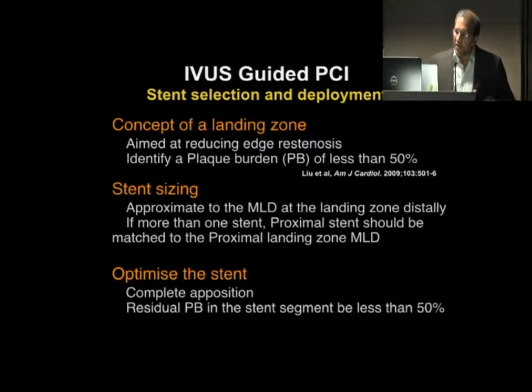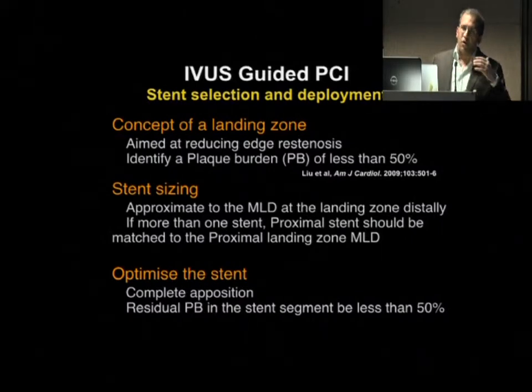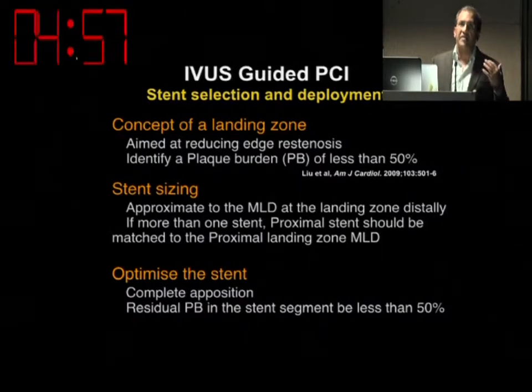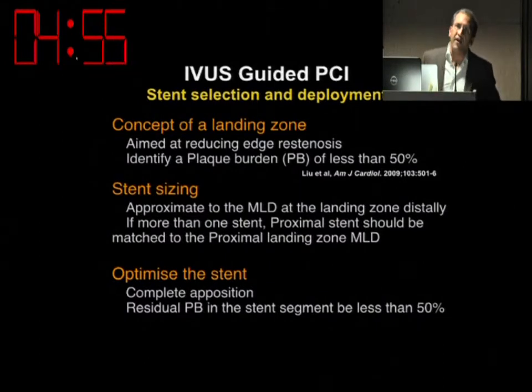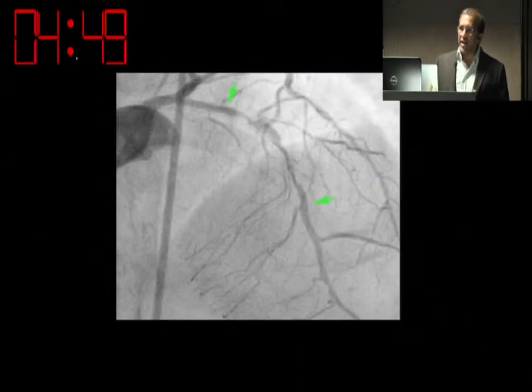So that's important. Stent sizing, as I told you, the MLD of a landing zone is fine, but you can also size the stent. The stent can be sized appropriately, and often in our practice we've seen that we've undersized stents in our country. And we'll talk about it. And apposition again. Going to cases.